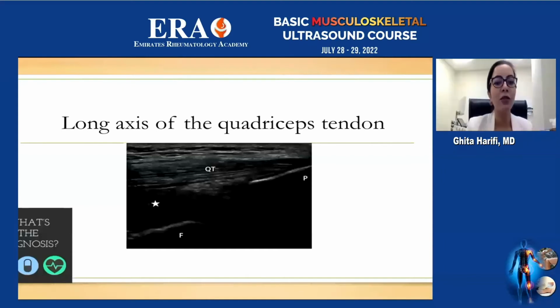Now, you might get a more complex joint effusion and not just anechoic material filling the recess. Sometimes you get something like this, which is a little bit more difficult to identify. Sometimes you have a fluid, but you have some synovial hypertrophy, and this defines, for example, synovitis. You have this in inflammatory pathology.